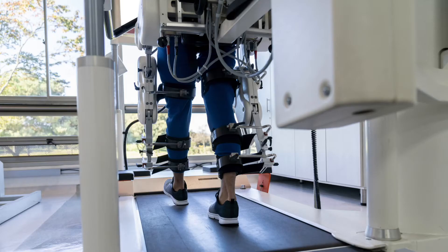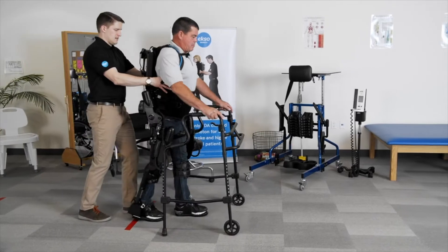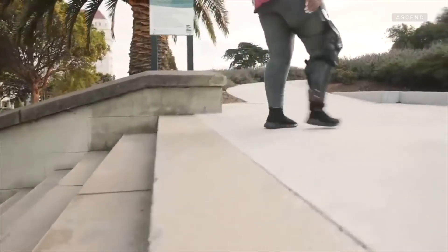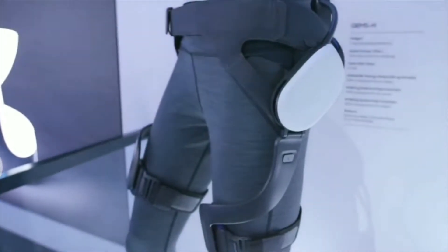In this lesson, we'll become familiarized with lower limb rehabilitation robots that are helpful for patients with lower extremity disorders. Lower extremity exoskeleton robots can be designed to help the movement of a specific joint, or they are designed for gait rehabilitation. They can also serve as assistive devices to perform activities of daily living.